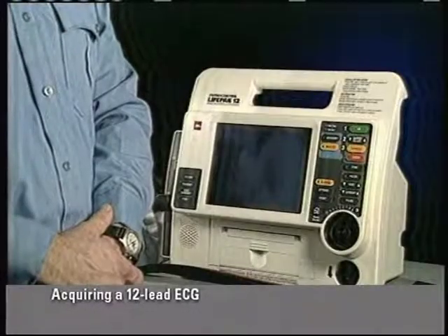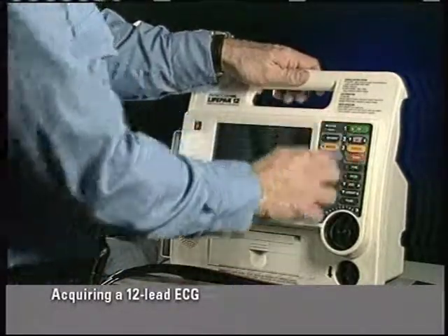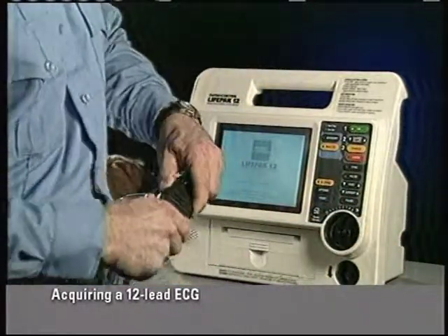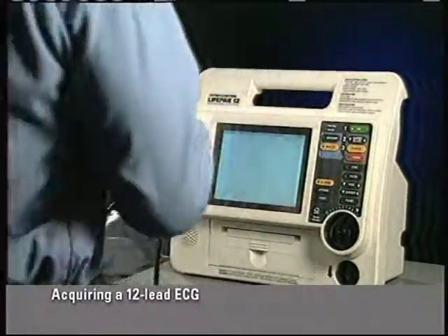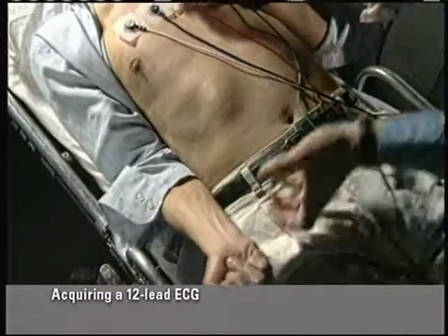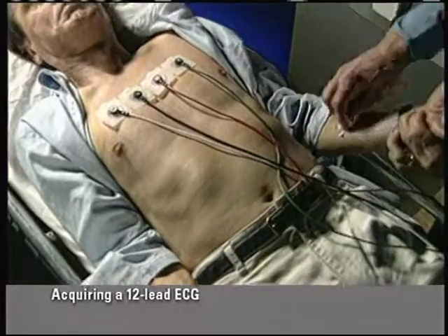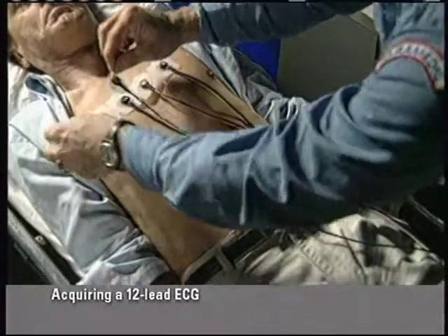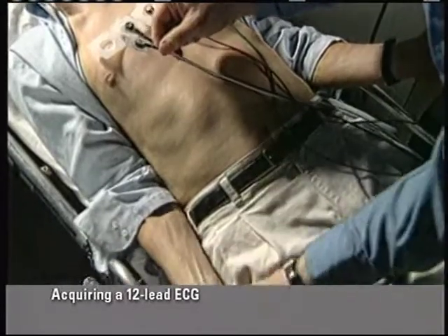To obtain a 12-lead ECG, power on the defibrillator and insert the precordial lead attachment into the main ECG cable. Prep the skin and place the ECG electrodes as previously described, but at the following sites. First, the limb lead electrodes are typically placed on the patient's wrists and ankles.